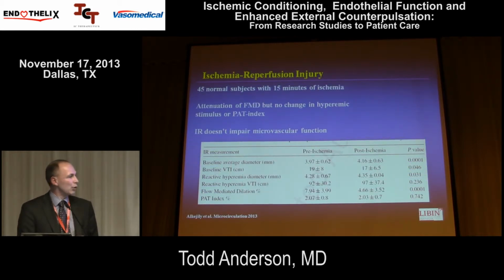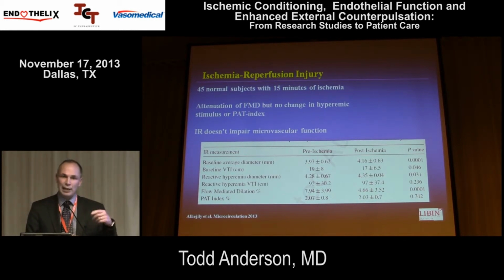We did one study in this domain that we just published in the last few months. My interest was in PAT to see if ischemia-reperfusion attenuated the PAT signal. So what we did is we took 45 healthy subjects with 15 minutes of ischemia and looked at flow-mediated dilatation, the hyperemic stimulus, and also the PAT index. And what we found is that flow-mediated dilatation decreased from 8% down to 4%, but there was no attenuation of PAT index and there was no attenuation of the VTI or the hyperemic stimulus. So the microvasculature was intact, but the conduit vessel response was attenuated with 15 minutes of ischemia.